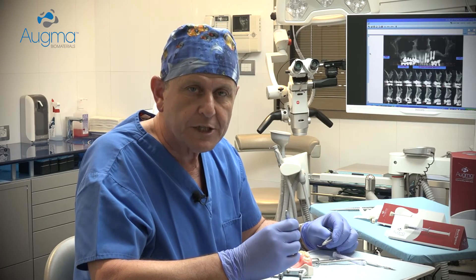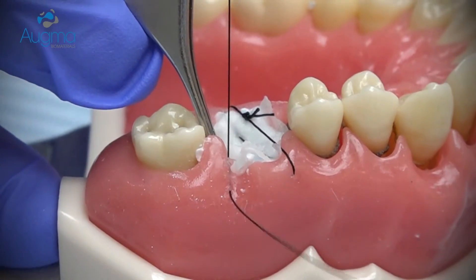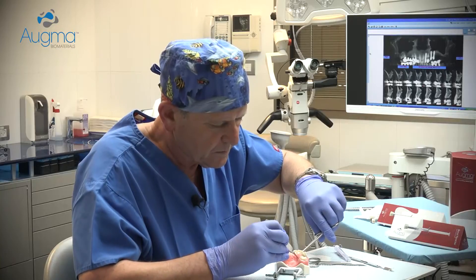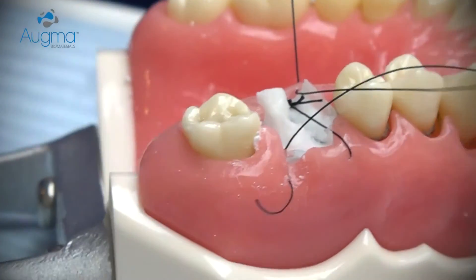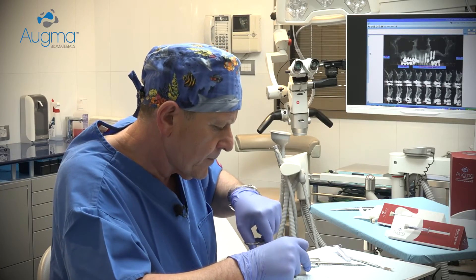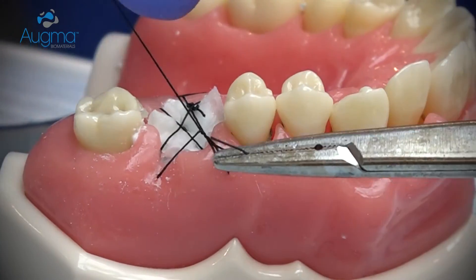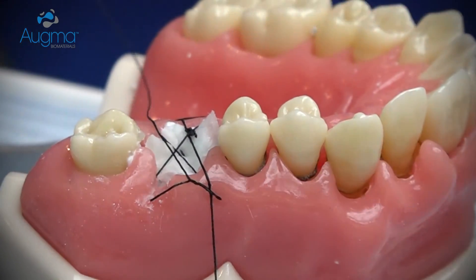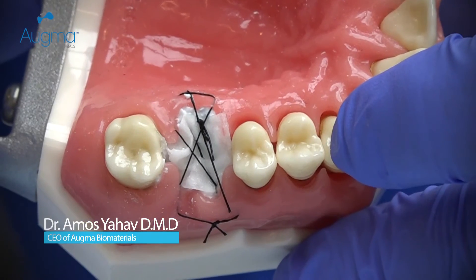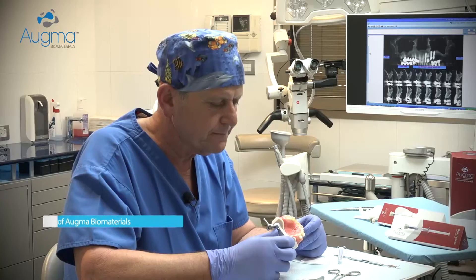After stabilizing the collagen sponge or membrane in place, continue with a criss-cross suturing in order to protect it in a better way. Now the graft is protected and you can leave it exposed. Soft tissue will migrate above the graft and will close the area. That's all.